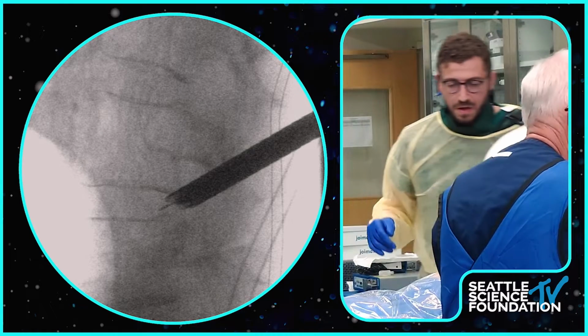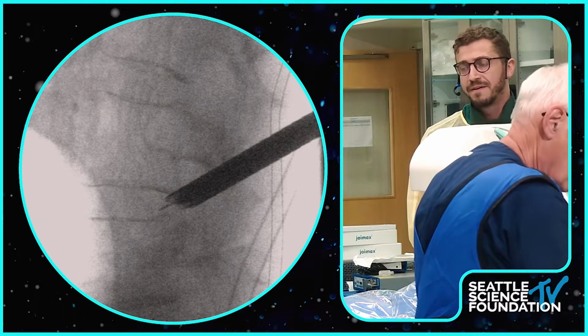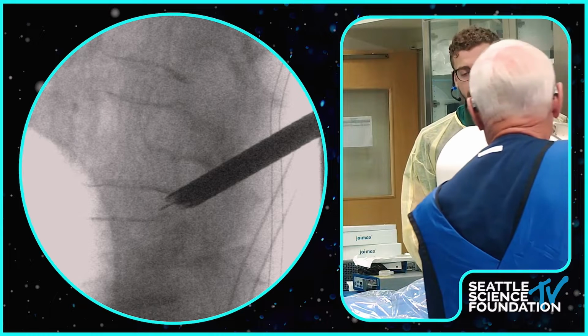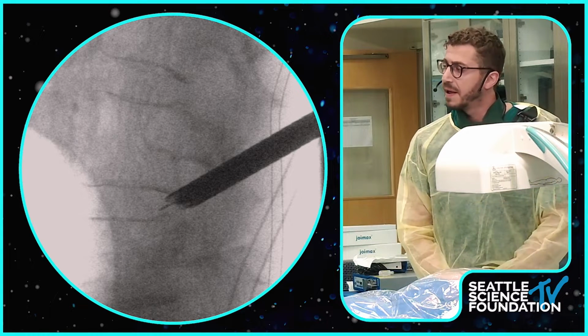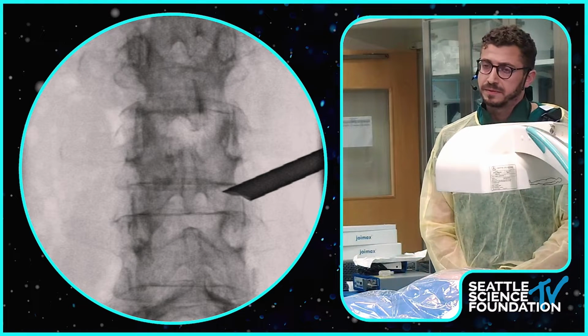Just a point for all the participants in the lab, what do you typically do for your lateral entry? I know Osama marked 3 lines, but what about you, Dr. Yoon and Dr. McGrath? What techniques do you use to get your lateral entry? Because I think there's a lot of variability.